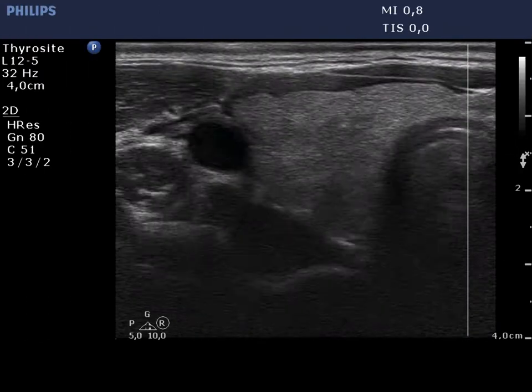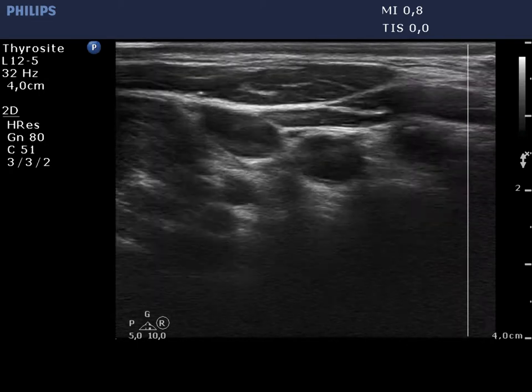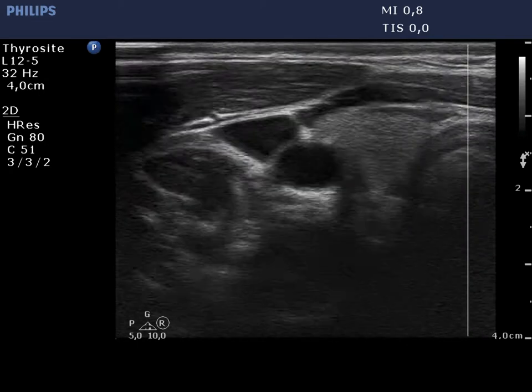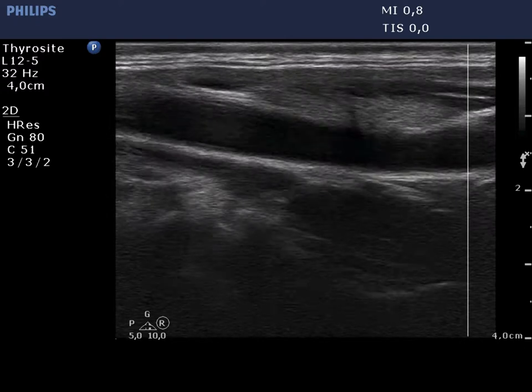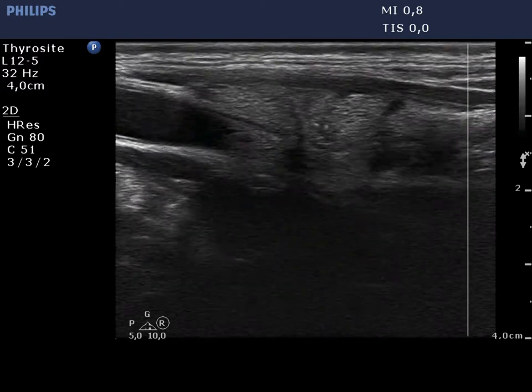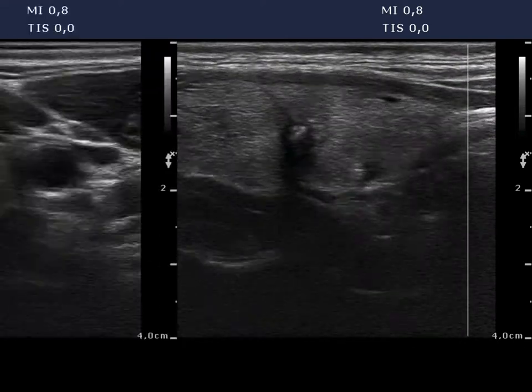The right thyroid is echinormal. There is a small hypoechoic lesion in the central part. It contains microcalcifications and coarse calcifications as well.